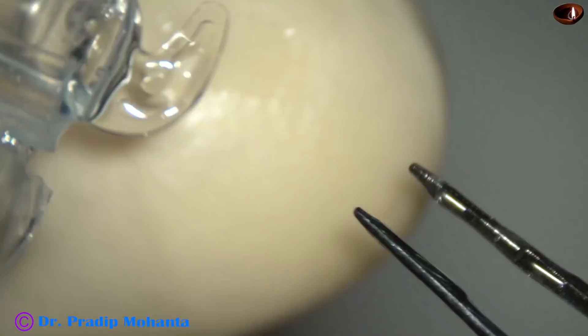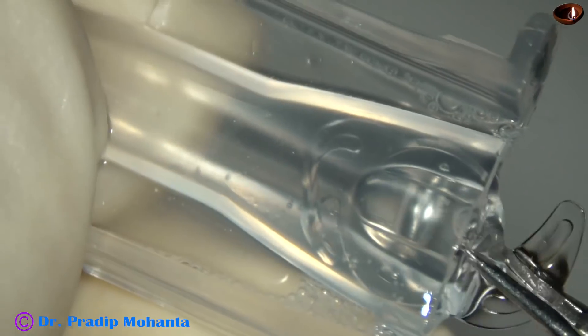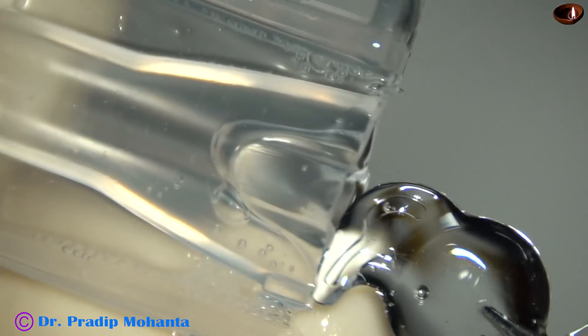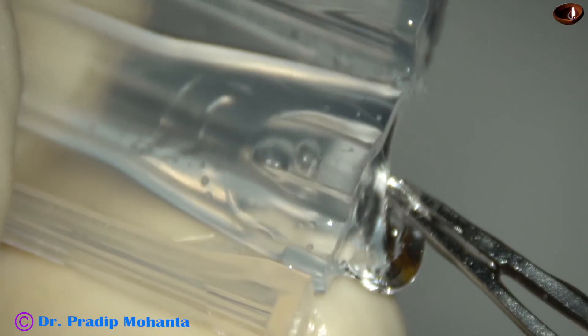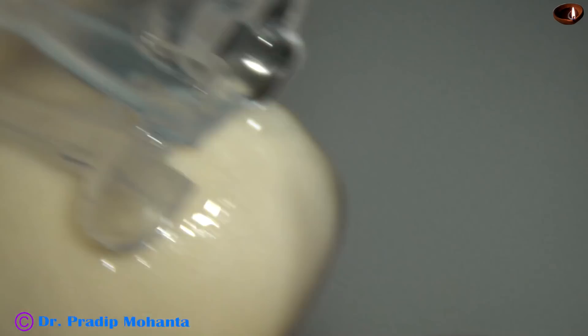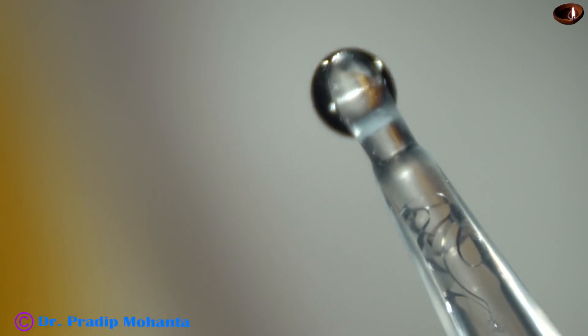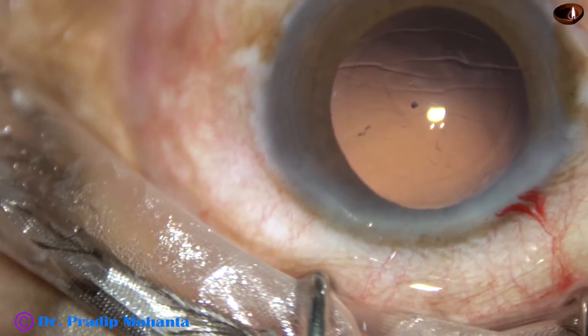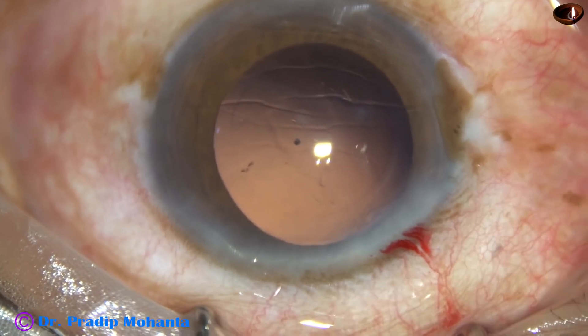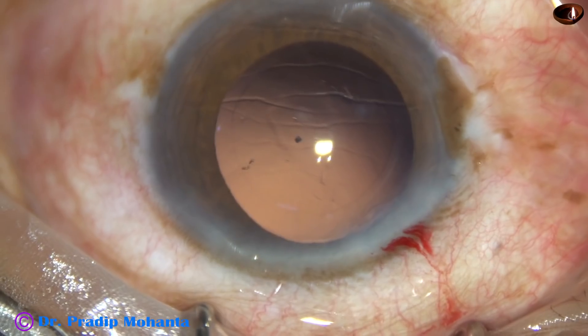And now this is a hydrophilic acrylic single-piece monofocal intraocular lens. It is loaded into a cartridge. Both the haptics are placed on the anterior surface of the optic of the intraocular lens. Now see hydro-implantation — the anterior chamber is kept formed by irrigating fluid.